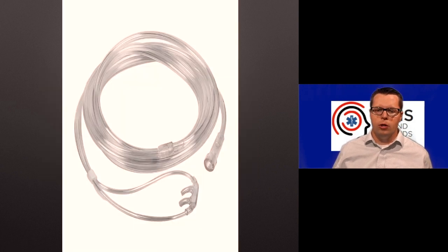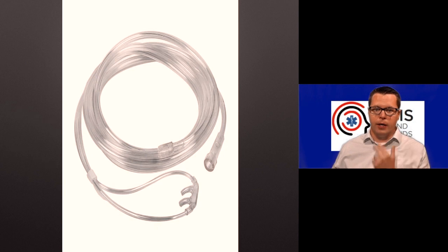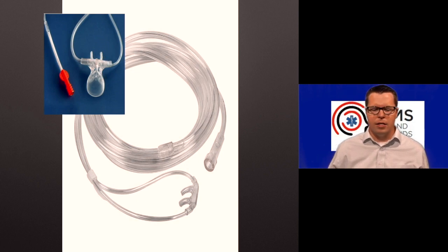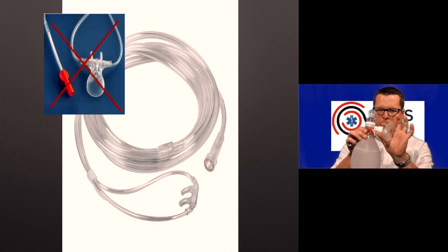Worth noting, too, you probably need the nasal cannula that has the prongs on it. The capno cannula in this case doesn't really deliver oxygen through those prongs. It collects CO2 through those prongs, but the oxygen actually comes out through little holes kind of down here, and it just kind of creates a pillow, and theoretically it kind of works, but it's really not designed to do that.